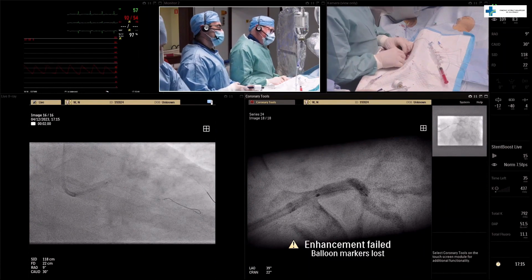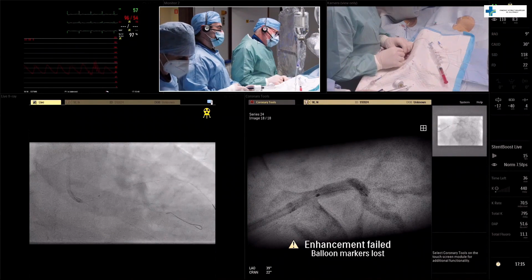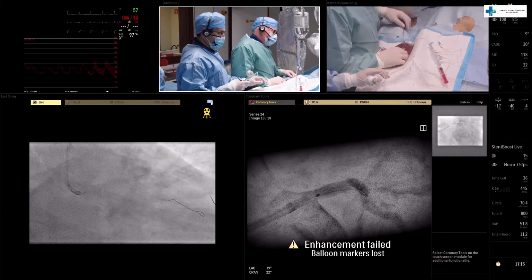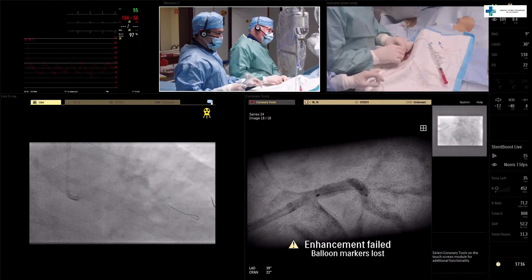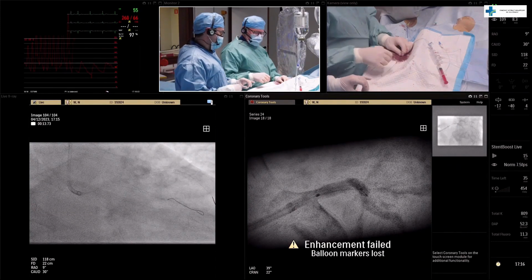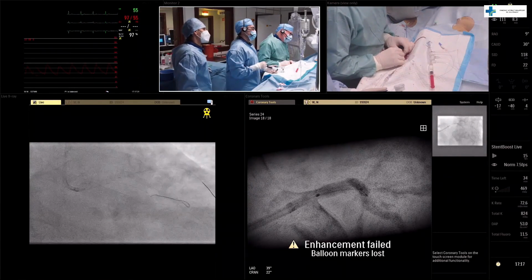Stent in the left main is now 3.5. Of course, the diameter of the vessel is 4.5, so we have to be very gentle with removing of the balloon and not very aggressive with the guiding close to the ostium because we can damage the stent. So I removed the balloon, and we will take another one, 4.5, 12 millimeter long non-compliant balloon. We have our 4.5 non-compliant balloon.